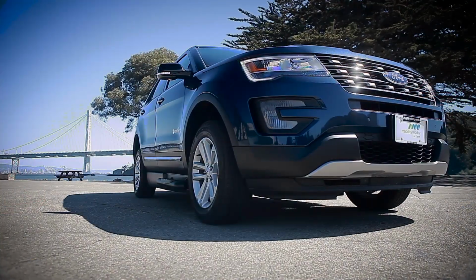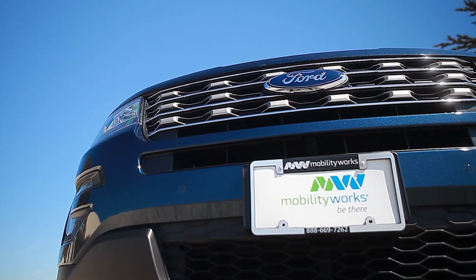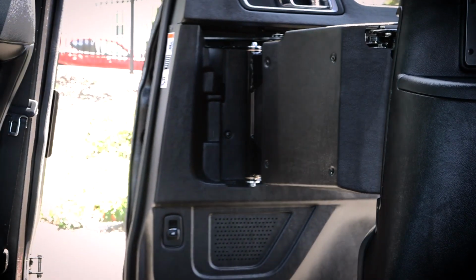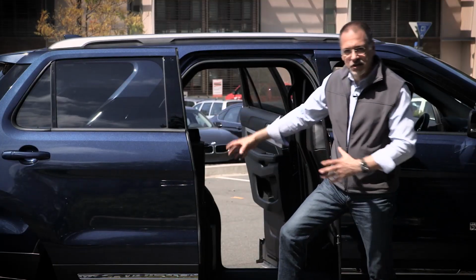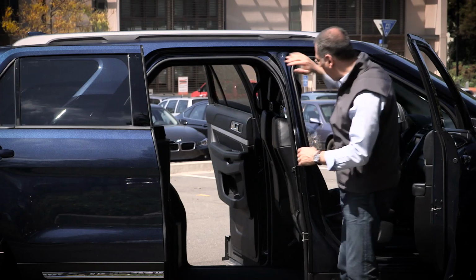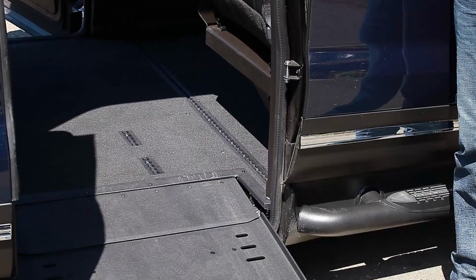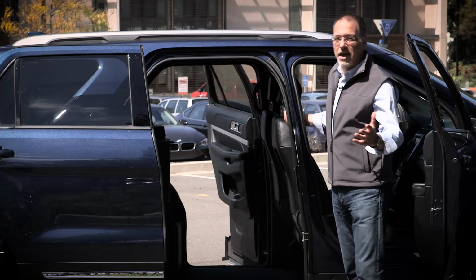Now, when Braun gets one of these Explorers, they don't just go down to their local dealer and buy a bunch of them and go on their merry way. This is co-engineered with Ford because it's major engineering. Look at this apparatus that had to be invented to create a pop-out door out of a hinged door. Similarly impressive is what they did to this B-pillar. Look how narrow it is now. This is a deceptively big deal. They had to carve this back to create reasonable, usable wheelchair access. I mean, look where the right side of that ramp hits. But at the same time, you can't give up crashworthiness.